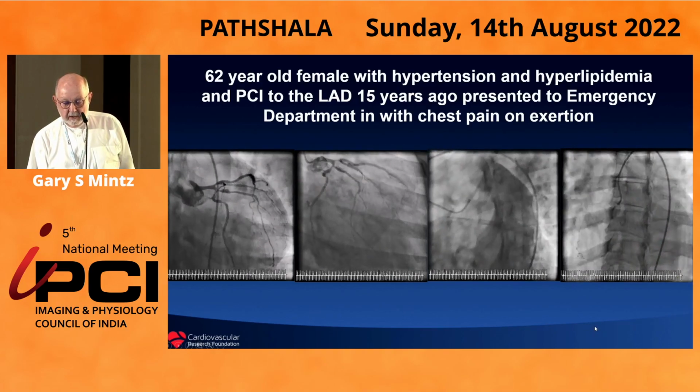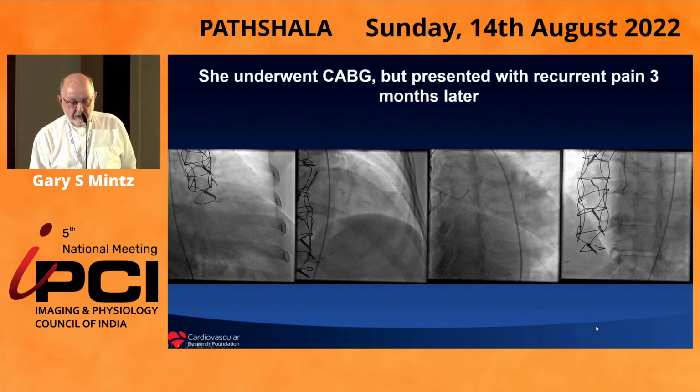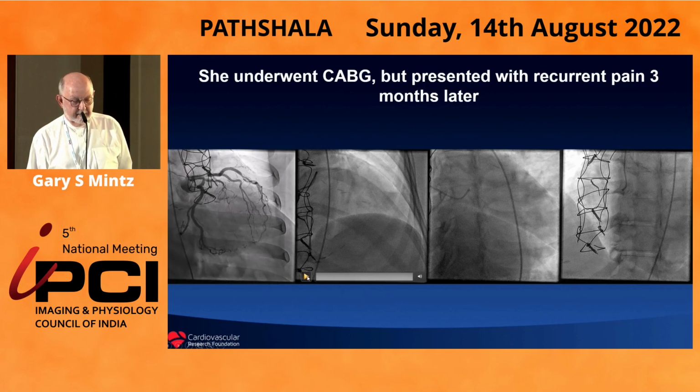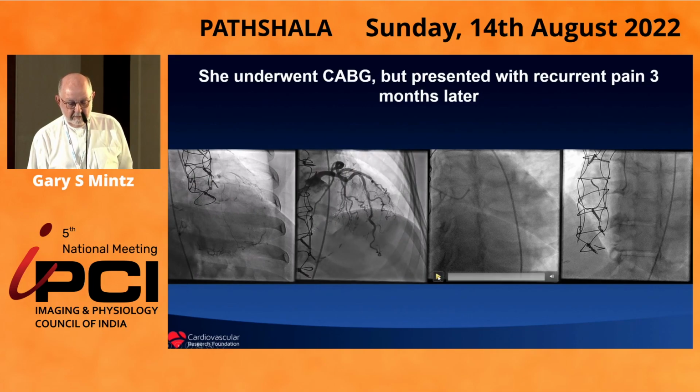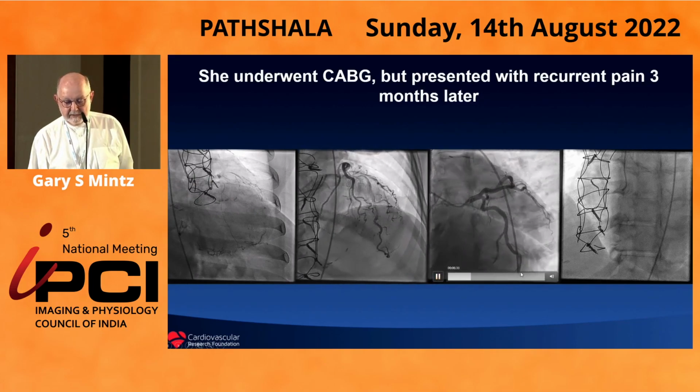So she was sent for bypass surgery, but presented with recurrent chest pain 3 months later. And this is her angiogram. Remember what it looked like pre-bypass.